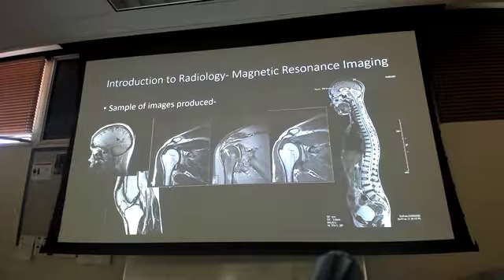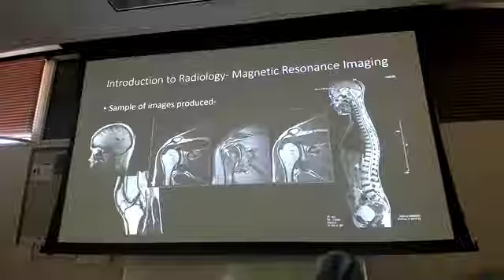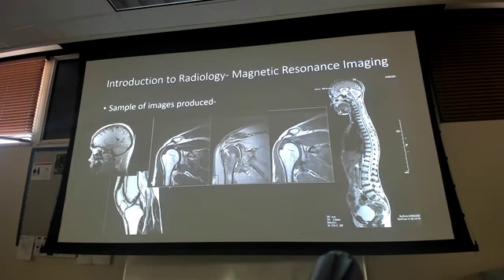So, really good for soft tissue, like I can see my ACL here on this part here. I'm not going to require you guys to pull out an ACL, or a labrum, and be able to detail it. From the MRI standpoint, for the most part, it's going to be, do you know when to order them, and when it's appropriate to order them, which we'll talk about with those conditions.